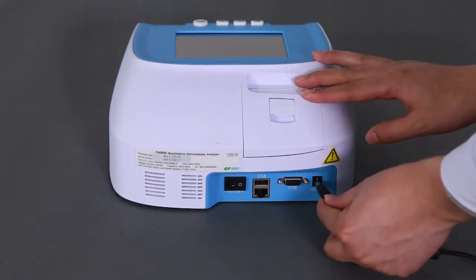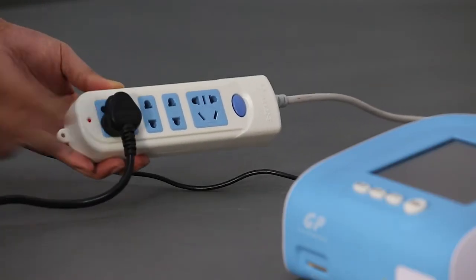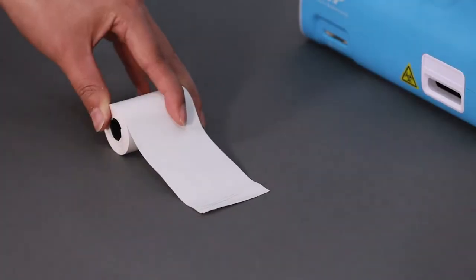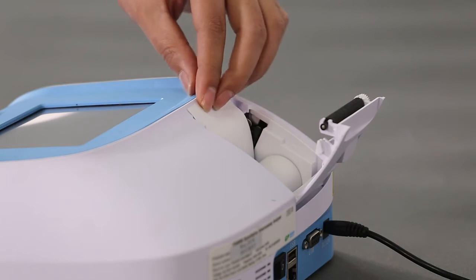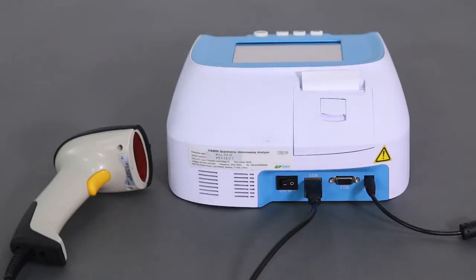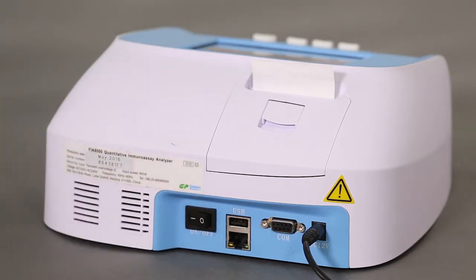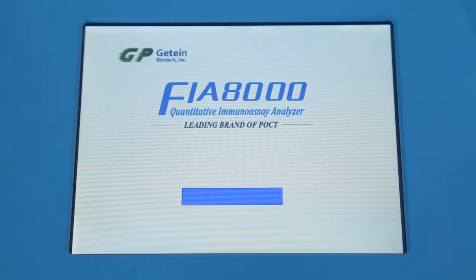Connect the power adapter to the FIA 8000 analyzer and the power cable to the outlet. When installing the printing paper, draw a line on both sides of the paper and load it into the print port with the side that has a black line facing down. Connect the barcode scanner to the USB port of the analyzer when installing it. Connect the power supply and the barcode scanner — which is optional — before turning on the analyzer.